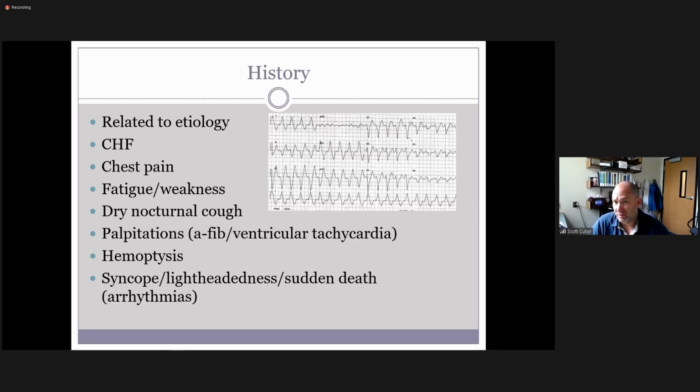So it's not that there isn't a cause to those things, it's just going to be a little bit more general than what we can diagnose in the echocardiogram itself. We're just going to prove the chamber sizes, we're going to prove what's going on with the heart, and then the doctor, the cardiologist, is going to take the rest of the patient's clinical information and put it together to determine what exactly is going on.